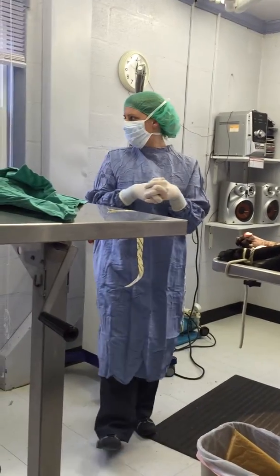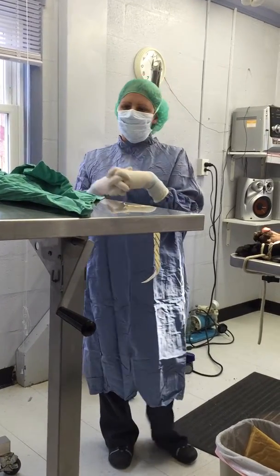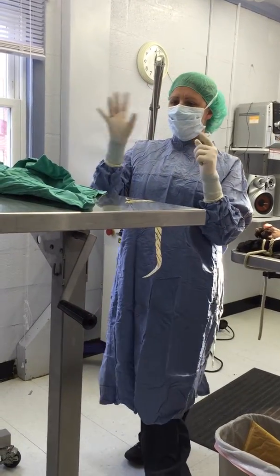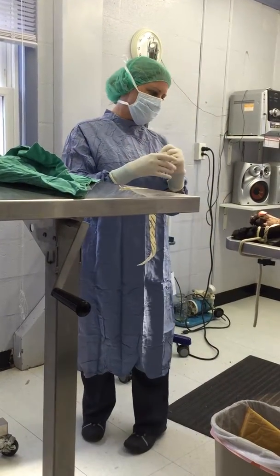So this is going to be task 12. Operating as the sterile assistant. So far what I have done — I've had my assistant go ahead and place the pack out. Everything has been cleaned in this room. The floor is always mopped every morning.